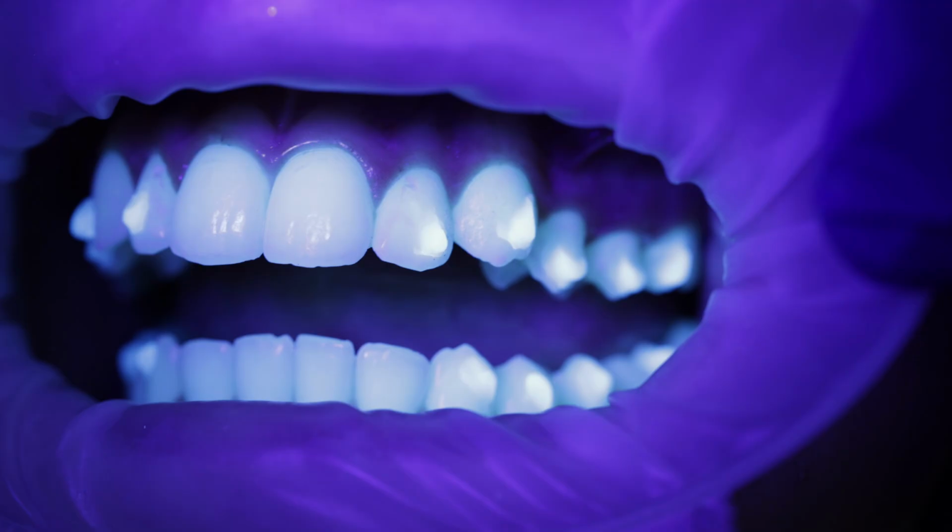The ultimate goal, and the only way that we are going to have movement and get to those exact movements that Align told us we would have, is because we're putting pressure on the teeth. And when we take a polisher and we polish all these areas, the patient might be more inclined to not wear their aligners. And I'm going to tell you, that's not me. That has been proven. So, patients that tell you that it's sharp, oh, it's cutting my gum tissue. Well, guess what? You shouldn't even know that because you should be wearing those aligners.